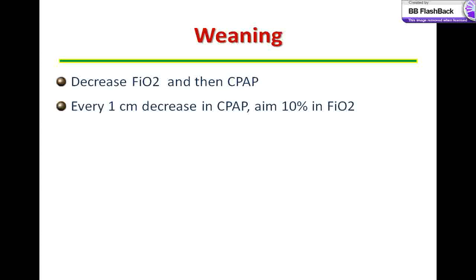down on the pressure. If the baby is on a pressure of 7 and FiO2 of 70%, come down on the FiO2 from 70 to 65 and then from 65 to 60 before you come down on the pressure from 7 to 6 centimeters of water.